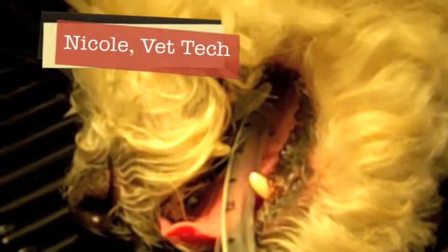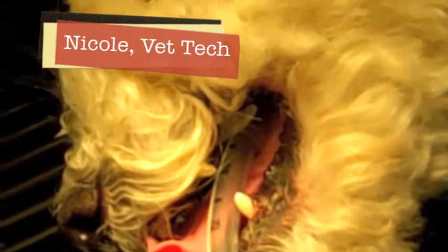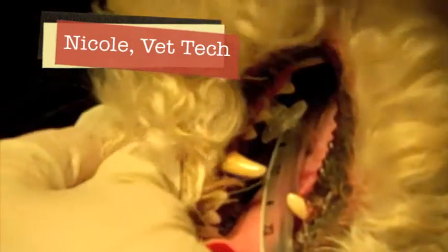We'll be demonstrating a dental cleaning for you today. So the first thing that we need to do is to look at the teeth and see if there's any large chunks of tartar, which this animal does have. And so we will have to take the large chunks off first and then follow up with some hand scaling, similar to when you go to the dentist for your cleaning. And the gauze is just to catch any tartar that falls so that the animal doesn't swallow the tartar.